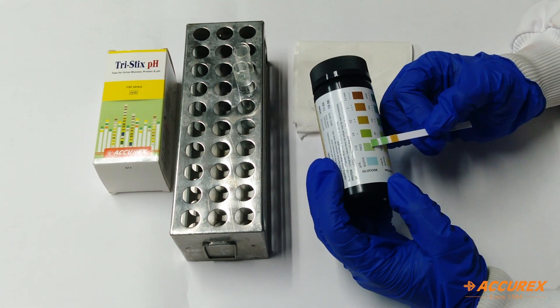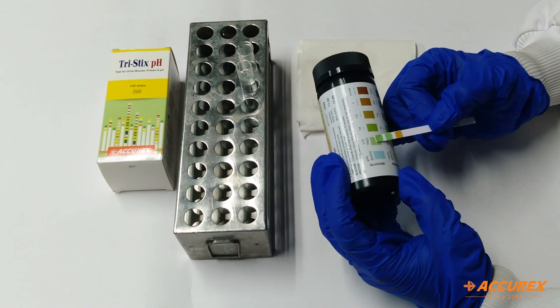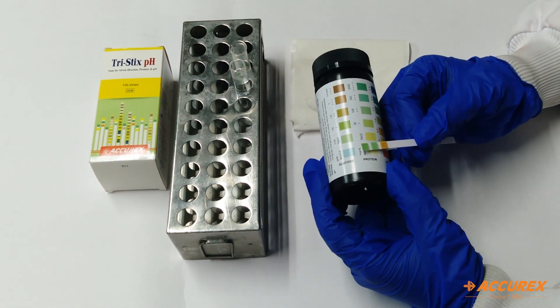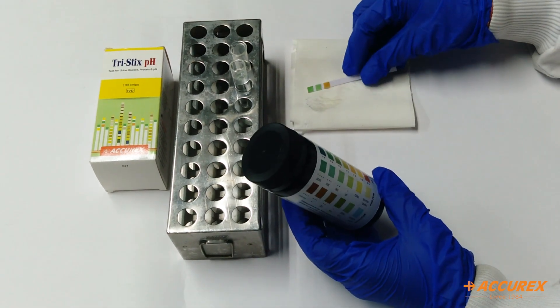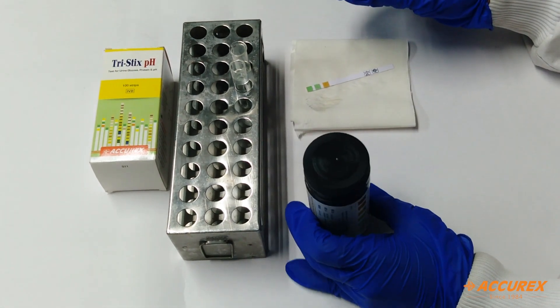Now for glucose you can see it is showing trace, and for protein it is showing 2+. In this way we can check 3 parameters within 30 seconds. Thank you.